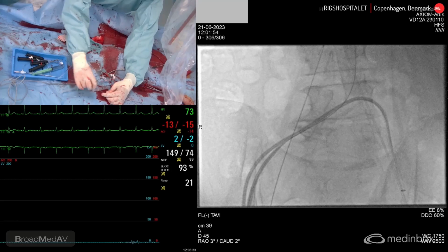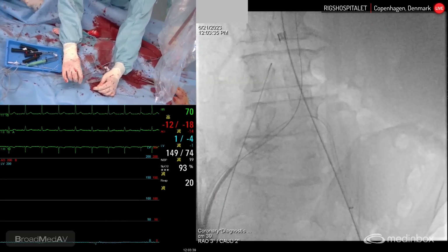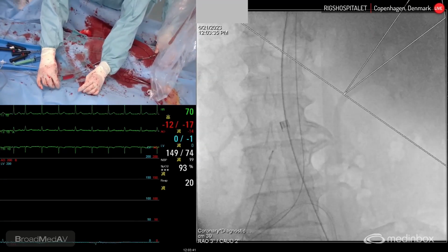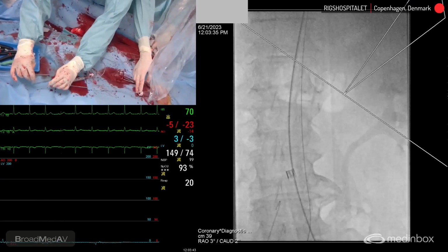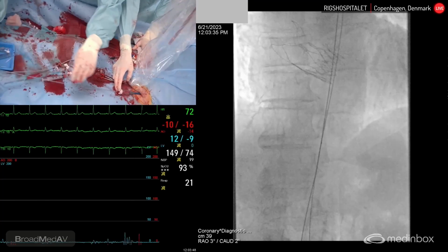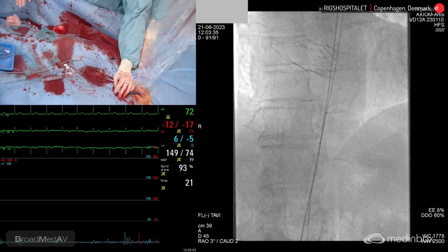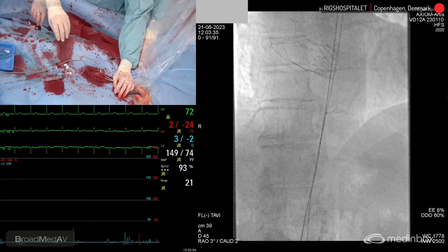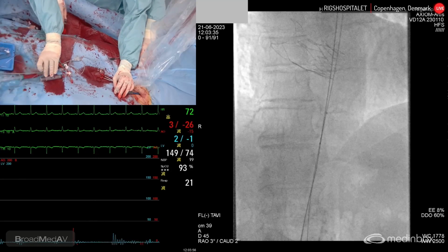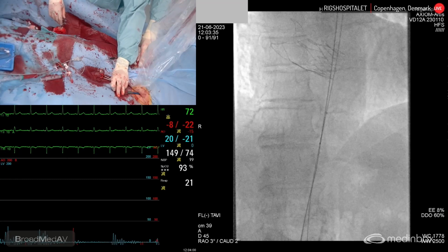Do you do this? I can't really. Do you do the steering there? And narrow the field maybe. No. All right. That's good. No, that's fine. Just put it, it's good. Don't go any further. Dilator on from the back sheath. All right, then we're ready for closure.